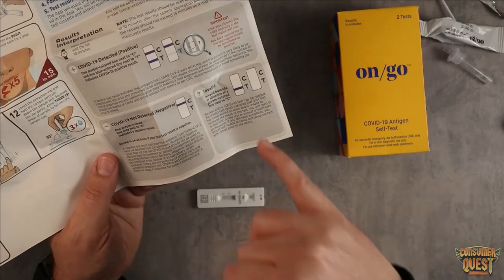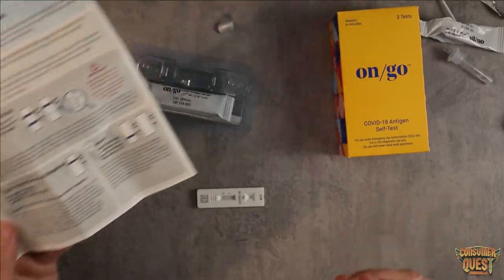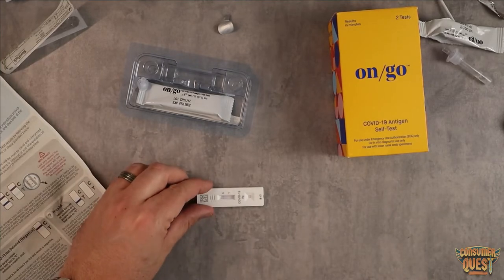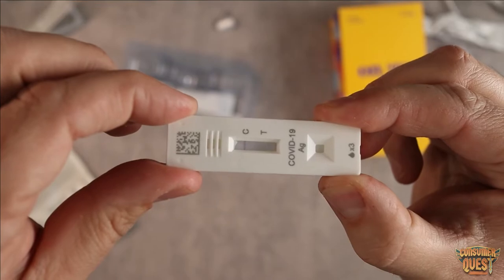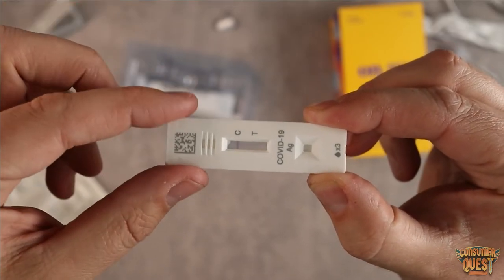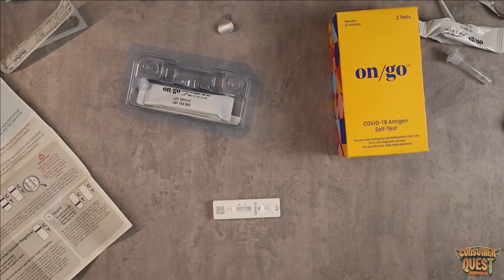If the C doesn't come up at all, you've got an invalid test — it's basically busted and you'll probably want to retest. Just in this short time while I've been talking, you can already see my C line has already appeared. So now I just need to wait 10 minutes and see if anything shows up in the T column to know whether I'm positive or negative. And that's it — it's that simple.